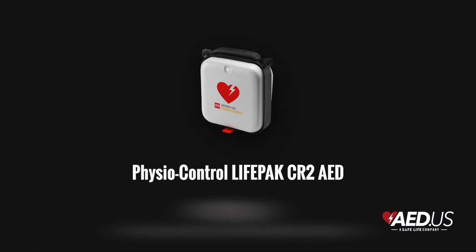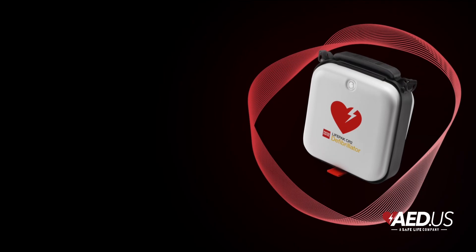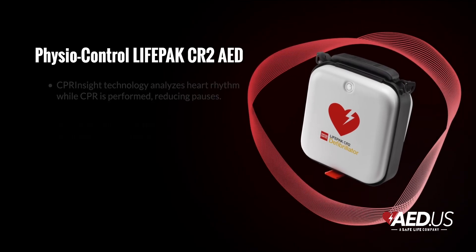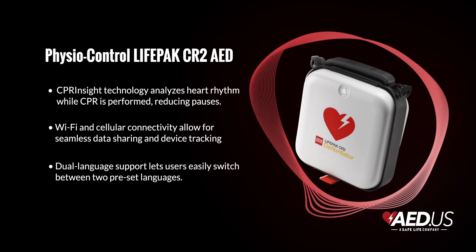Whether you're a seasoned responder or stepping up for the first time, the CR2 is built to guide you every step of the way. Let's take a closer look at what makes this AED a game-changer. The standout feature is the CPR Insight Analysis Technology, which lets the AED analyze the patient's heart rhythm while you perform chest compressions.